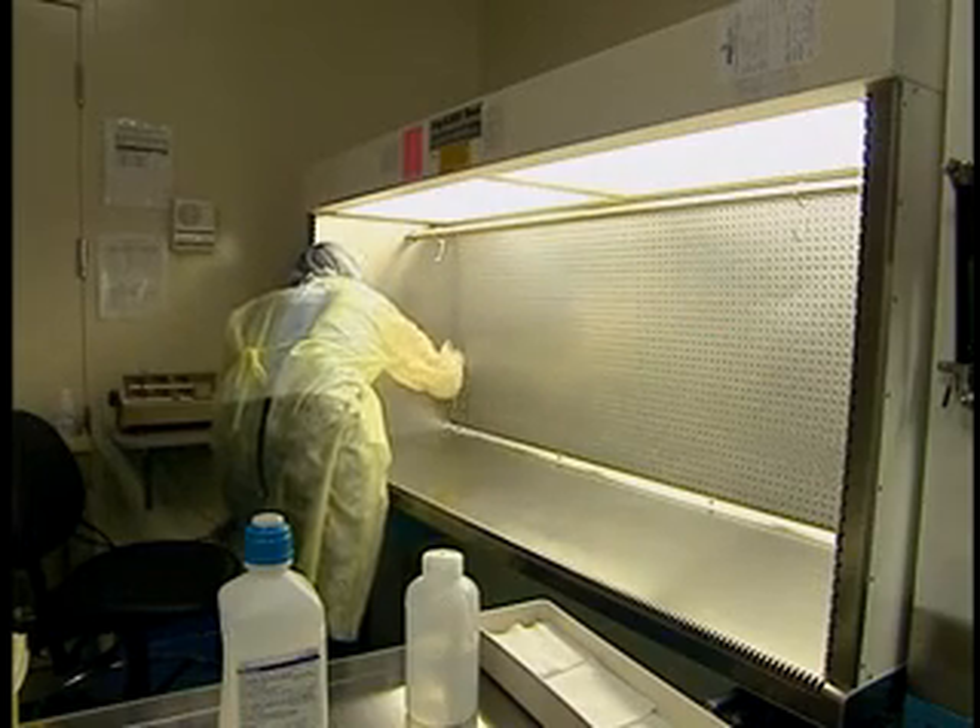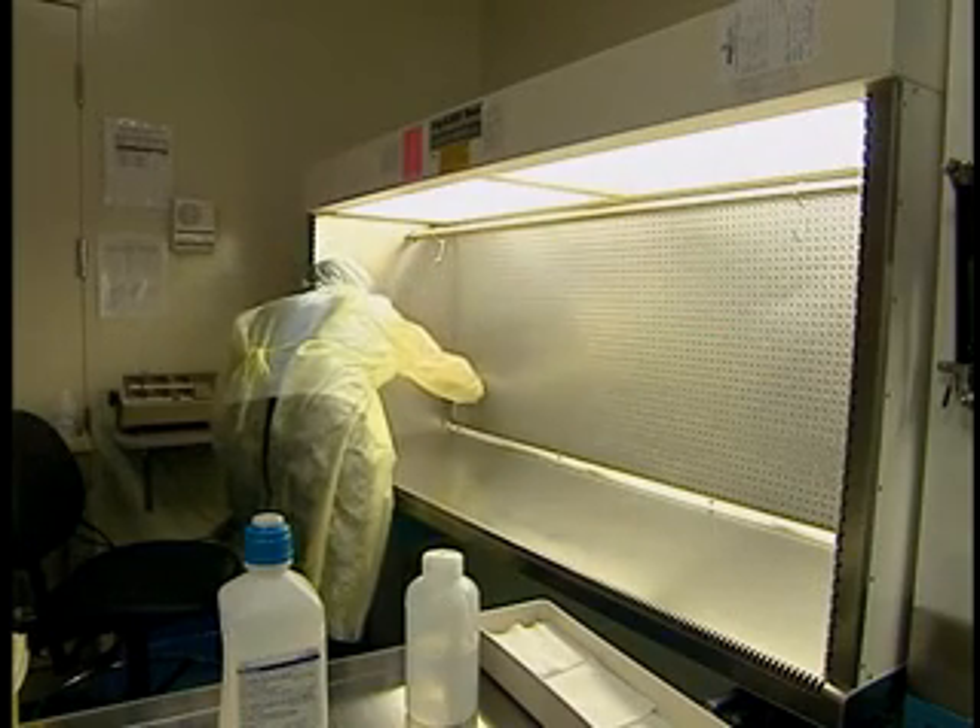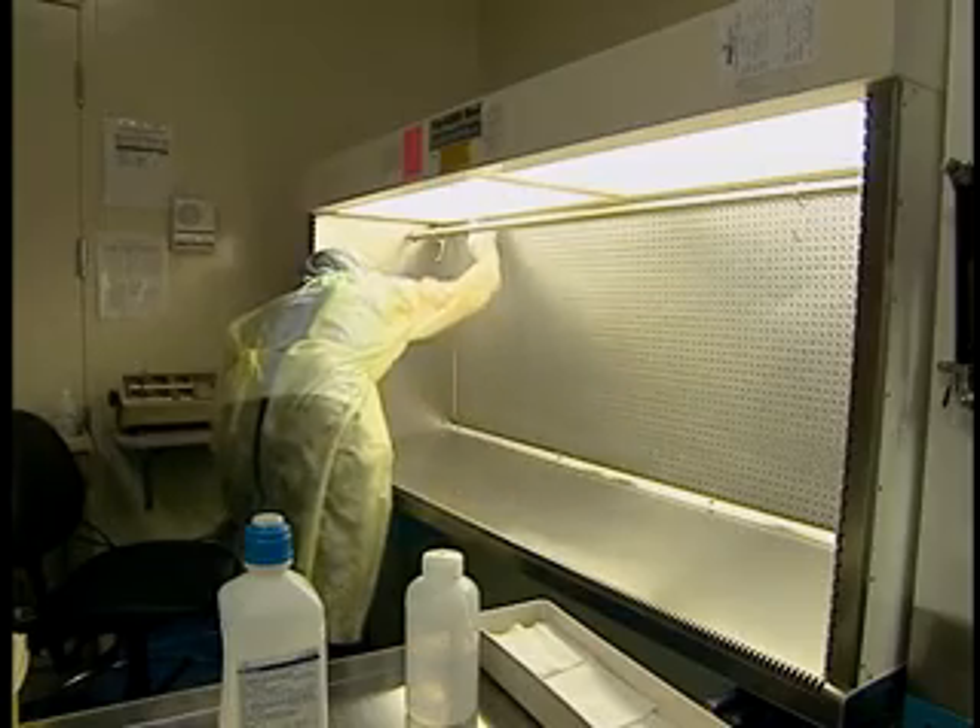Once a week, remove everything inside the hood and use a slightly moist gauze to clean the protective grill on the HEPA filter.